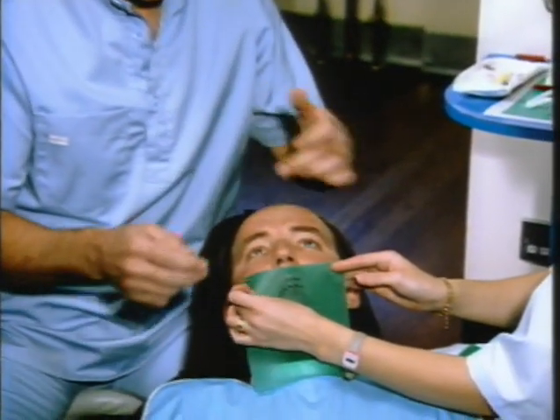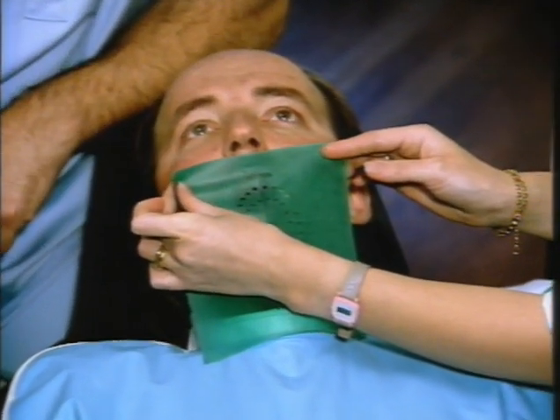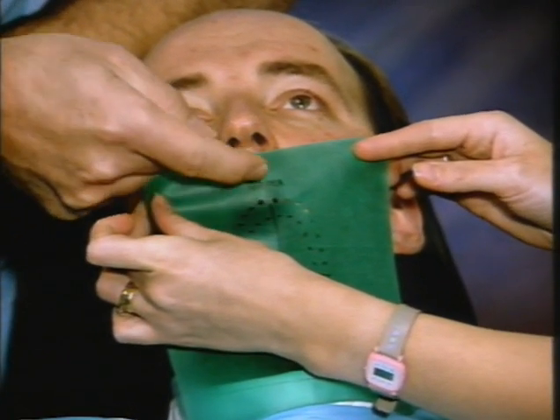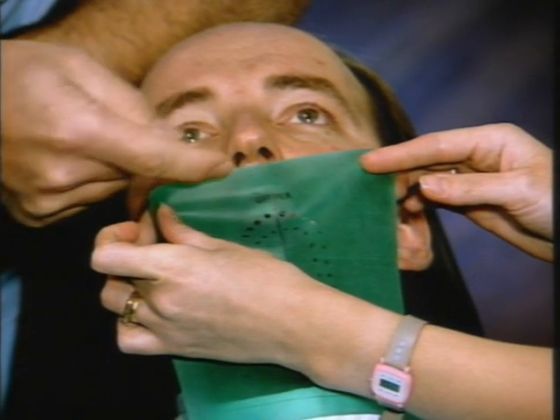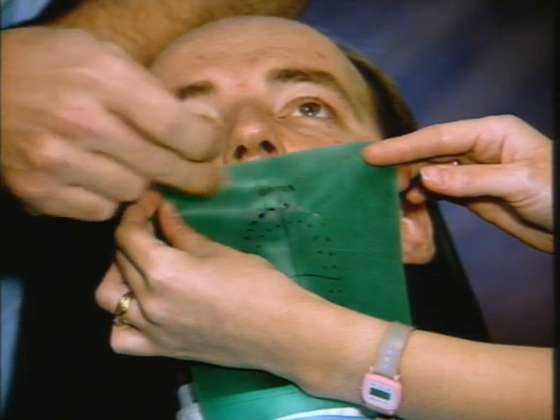Now that we've looked at the individual tooth positions, let's look at the position of the dam as a whole relative to the face. Normally, if you're working on the upper anterior segment in the mouth, then the holes for the incisor teeth should be placed centrally. They should be about an inch below the top edge of the dam. This allows you to have the dam in position without covering the nose apertures.